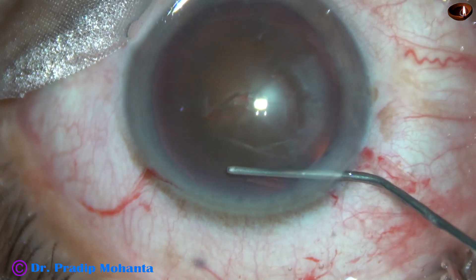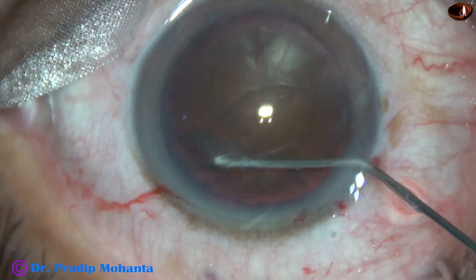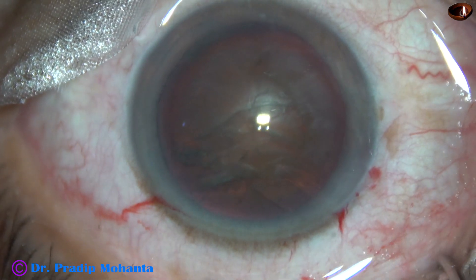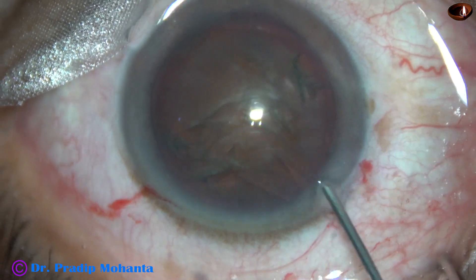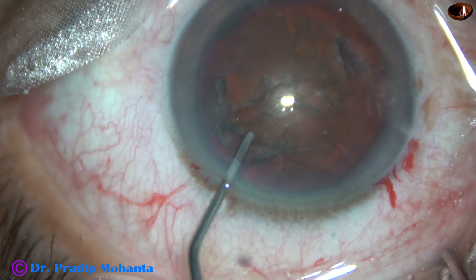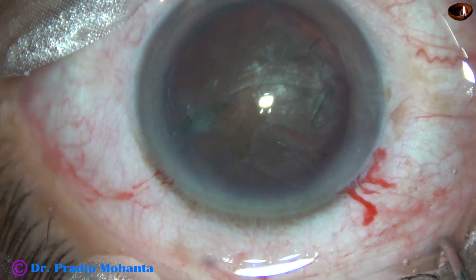Hydrodissection is done. BSS is passed at multiple places. The nucleus is tapped. There should not be any fluid build-up behind the nucleus.